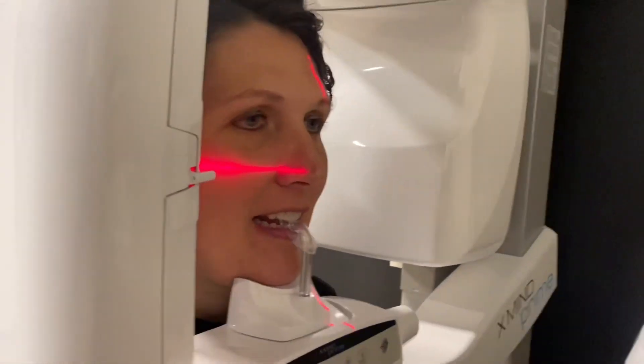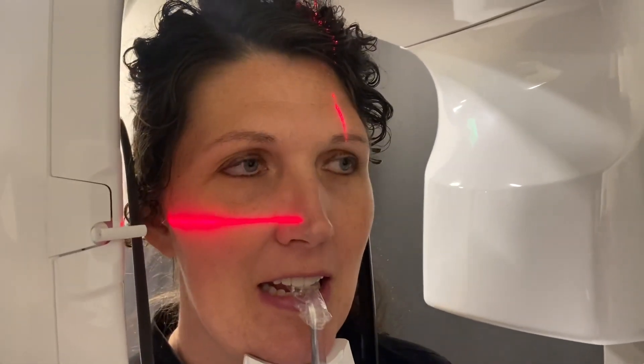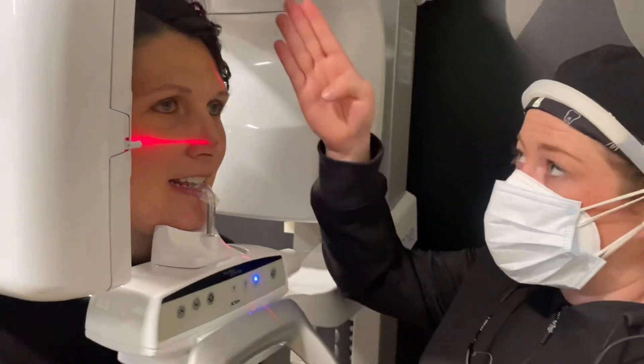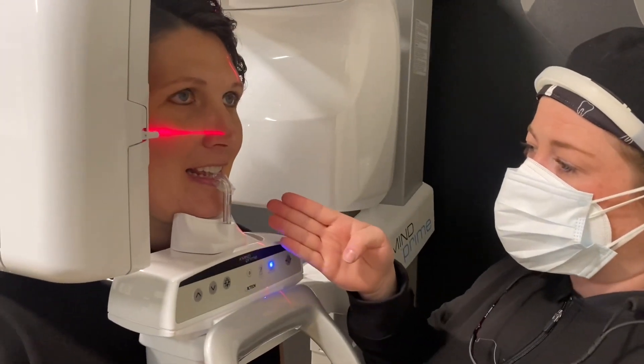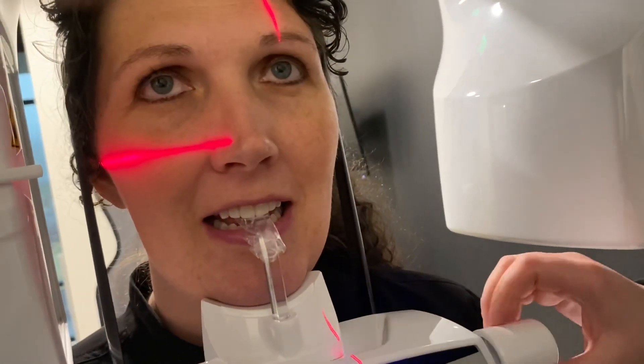We need to bring this down just a little bit. That looks pretty good. And then line up your canine line with the canine. And she's looking awesome, so lock her into place.